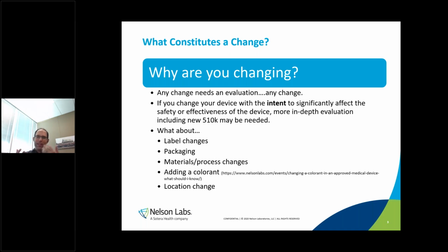I always joke, but it's actually probably not much of a joke, that engineers just love to fiddle with things. They just love to change. And yes, I think we all want to make things better and more efficient and more safe and things like that, and those are great changes. But sometimes we're just changing because it's time to put out a new version of the device. And so we're changing a little bit here and there. Those are a little bit harder to justify from a risk-benefit ratio.